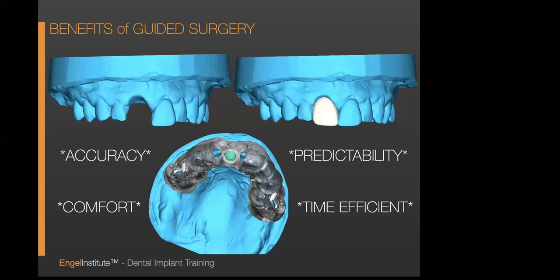Time efficient. I'm not one that believes in looking at time as a measurement of money, meaning how to be more profitable as it relates to time. Do you know how much time this has taken you? And if you can break that down to dollars, here's what it means. I'm not a fan of that thought process. We are not attorneys that bill by every 15 minutes. We're doctors that are supposed to achieve a result. Now, with that being said, I really love doing a full arch case in 24 minutes instead of 2.5 hours. So while I don't look at it like it can save me time, which can save me money, I look at it like we can get through this a little bit quicker.